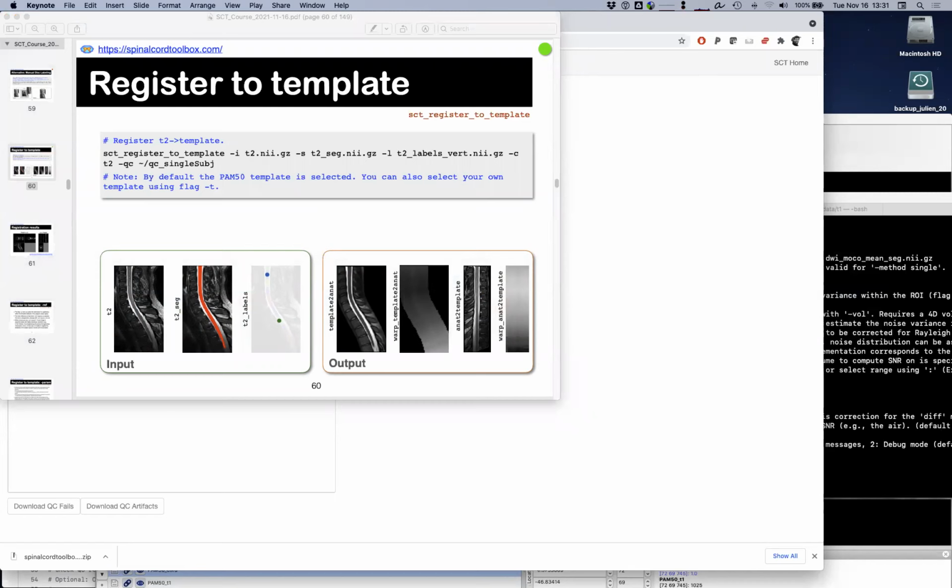Are there any questions? Julian, I just have a question regarding the 7T template, which I just found out about a few weeks ago. If we have our 7T data, how should we go about using new templates, which might just be available, but maybe not thoroughly tested? Should we try to use the current templates that are available and then maybe try to load the 7T templates and try them and compare? Or how do we even approach something like that?